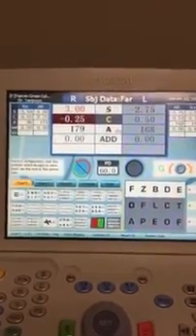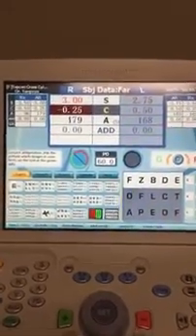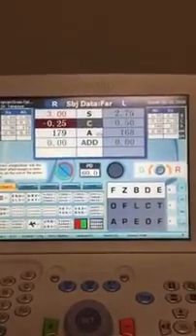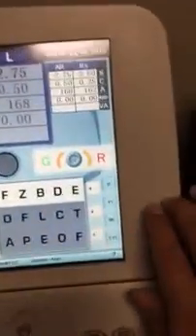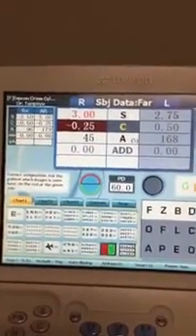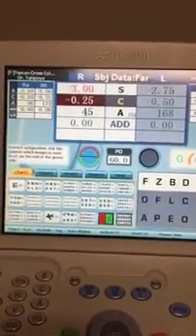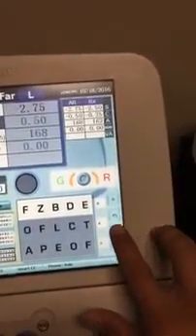Okay, so if they say green, that is a rejection of the correction, meaning you do not add the astigmatism correction or cylinder. So we'll move on to the next major axes. So let's go to 45. So I'll tap 45, and you can see that the whole thing rotated, and it says 45 up here. So we're screening at the 45-degree axis, and you say which one's clear, top the red, bottom the green. Let's say they say green again. So we'll go down to the next one. Let's do 90.